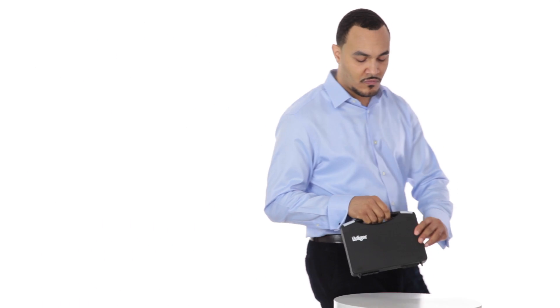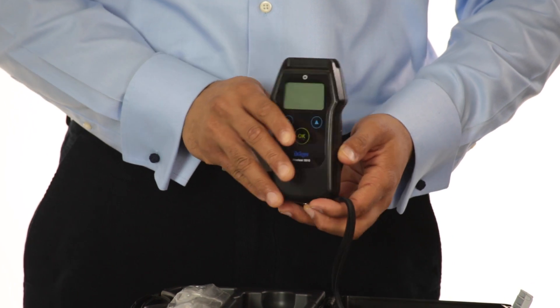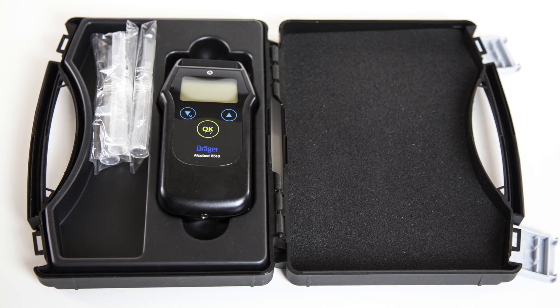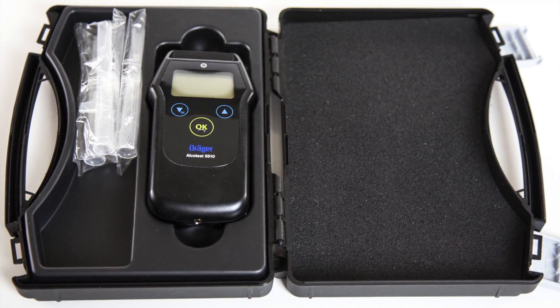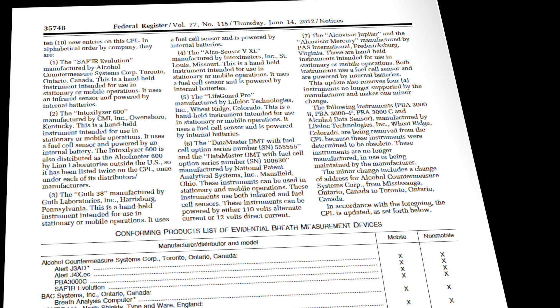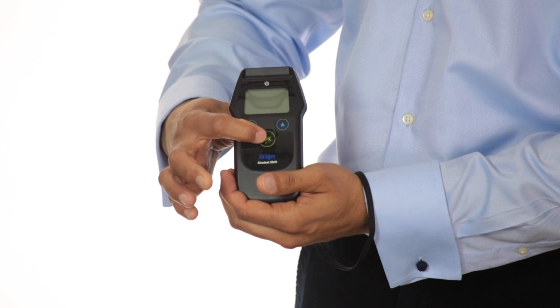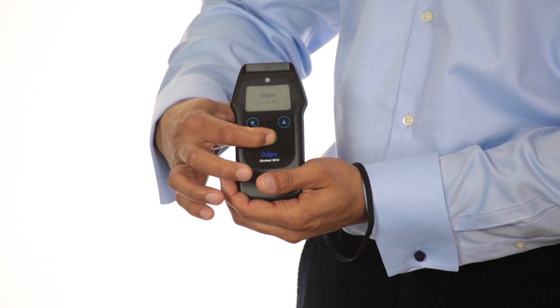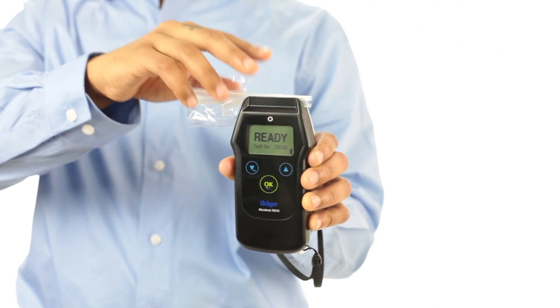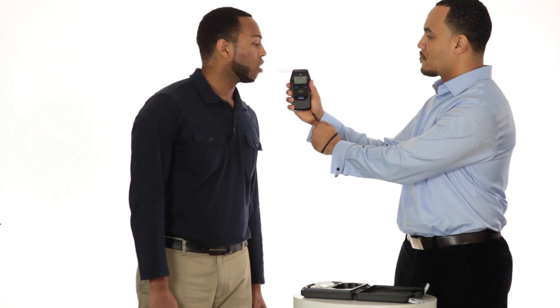The Draeger Alkotest 5510 provides fast and accurate breath alcohol analysis in a compact, user-friendly device, whether you are right or left-handed. The Alkotest 5510 meets the requirements set forth by the National Highway Traffic Safety Administration's model specifications for evidential breath alcohol testers and is included on the conforming products list for evidential breath testing. The device uses Draeger's quarter-inch electrochemical fuel cell, which is alcohol-specific and not susceptible to other substances found in a human's breath, allowing fast and accurate results even at high alcohol concentrations.